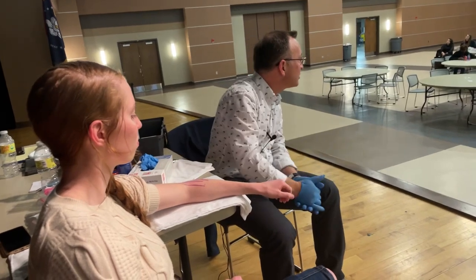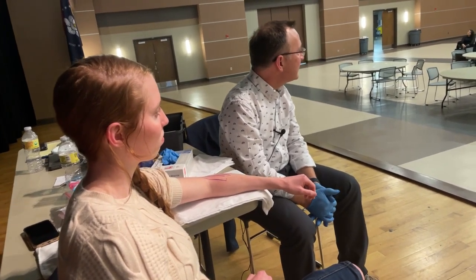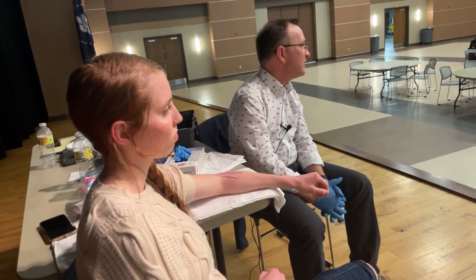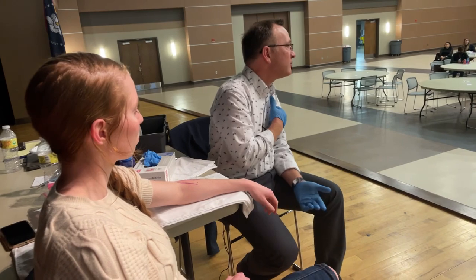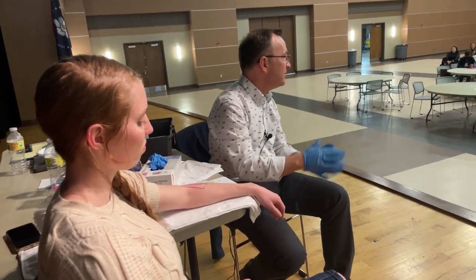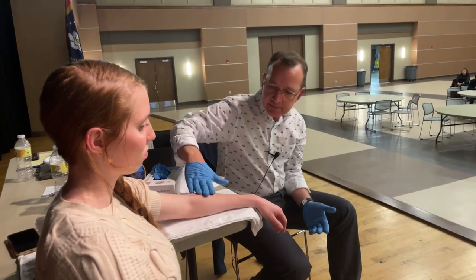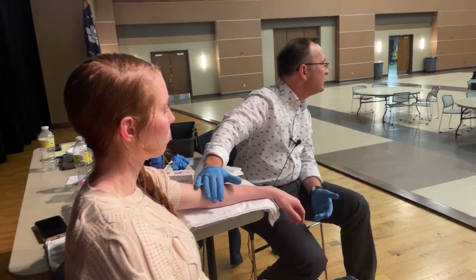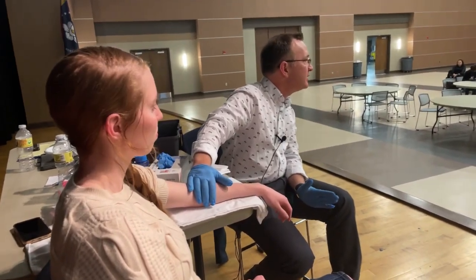For Katie, since I didn't get a lot of twitching locally, I may come up to her supraspinatus, subscapularis, or different muscles that can refer to the lateral elbow. I treated a young lady — a college golfer — with medial elbow pain, negative nerve study, negative MRI. It was right when I became needle-certified, and it was my first aha moment. Pec minor referred pain to the medial elbow, and after one needle session she was done and better. Releasing those trigger points from her pec minor was a game changer. No drops of blood from Katie — that's typical. With 20 needles you might have one bleed, but it's not common to see a lot of blood with dry needling.